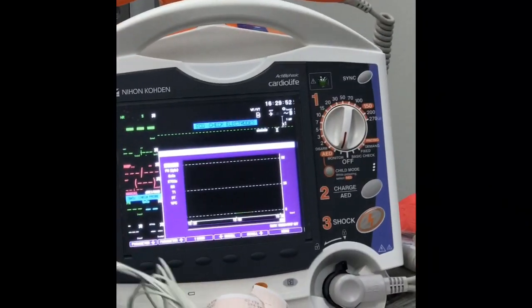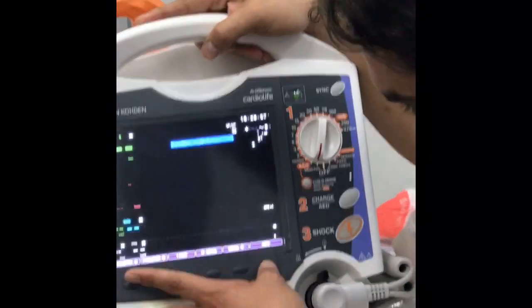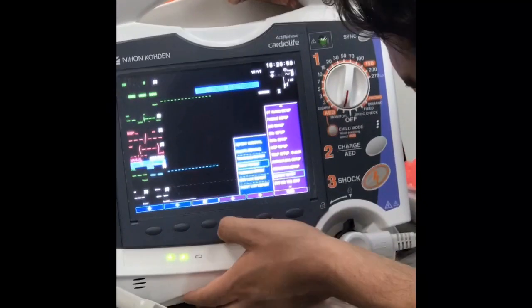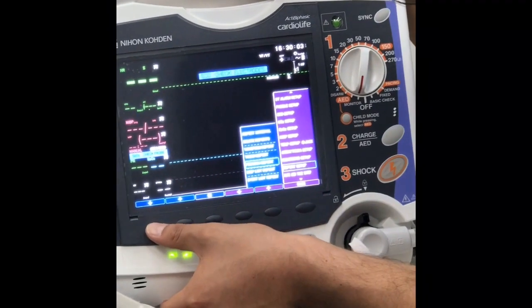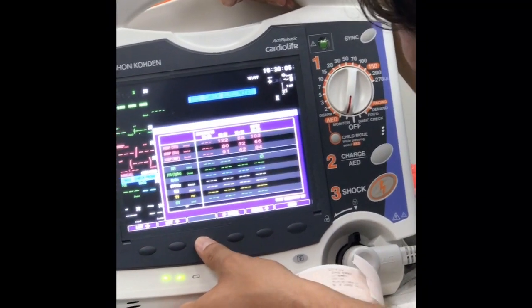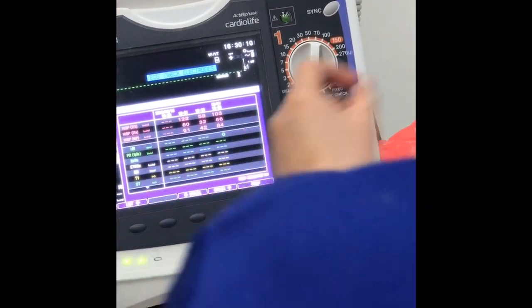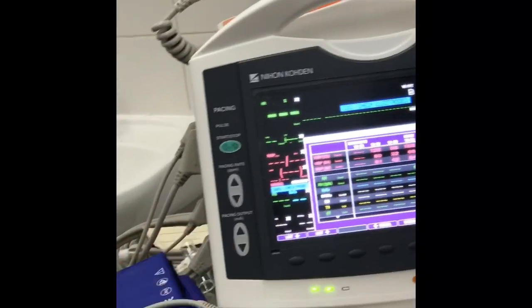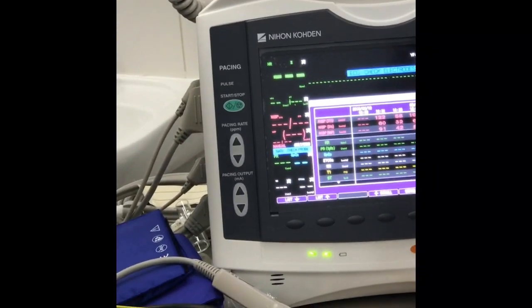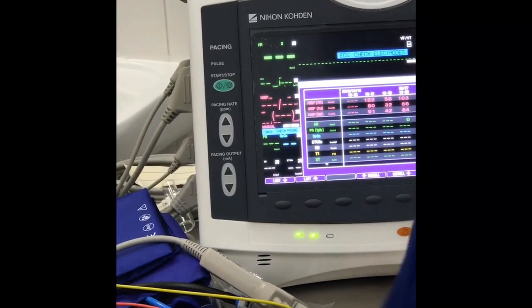Go to the NIBP list. This is NIBP in this session. This is a trend, every minute. So we go to the NIBP list, then it will come out all together. We can print. Yeah, it's printable. Menu. Record, at the bottom. Only one print. Yeah, it's printable. Good.